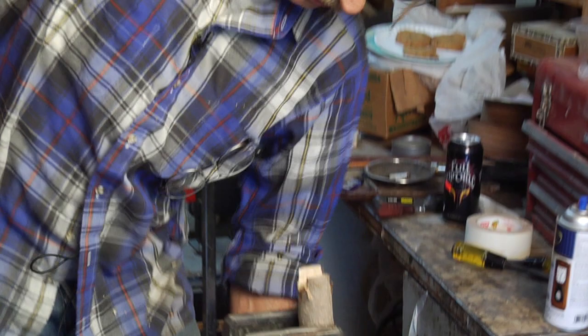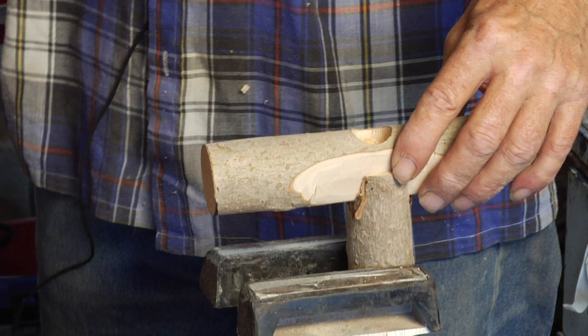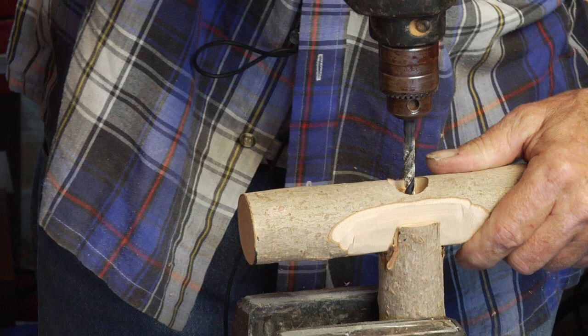I've set the body of the cane in my little vise here, got it pretty tight. Now set this piece in the slot and get it pretty much in the middle — about there will do. You just got to kind of hold this still. Take your drill and drill through the first hole and down into the cane.